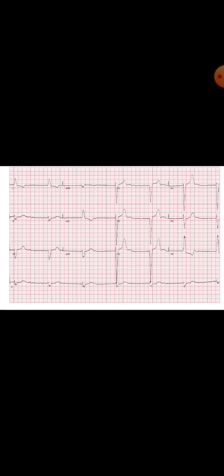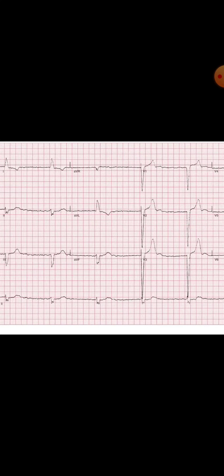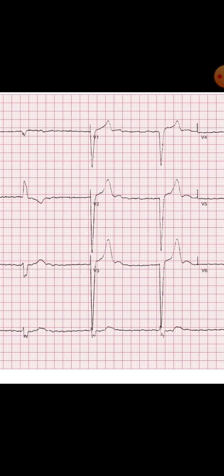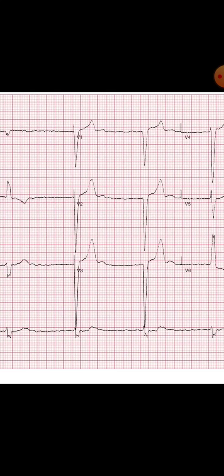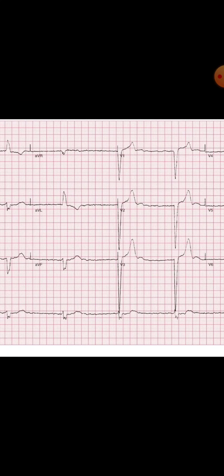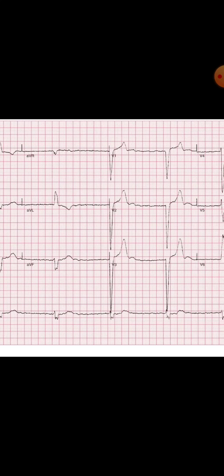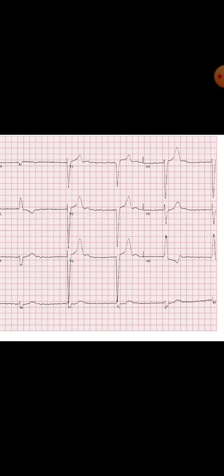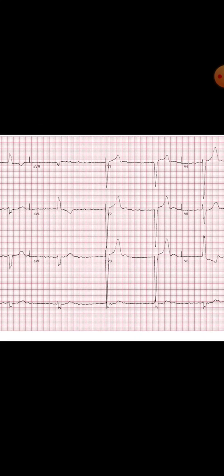Next, let us look at the P wave, the PR interval, and the morphology of the QRS complex. Focusing on the rhythm strip and other leads, we cannot find a P wave. Rather, there are fibrillatory waves present just after the T wave. So there is no P wave, which means the patient is having atrial fibrillation.